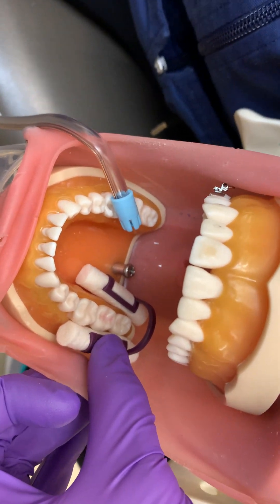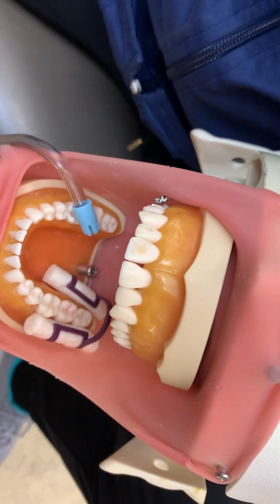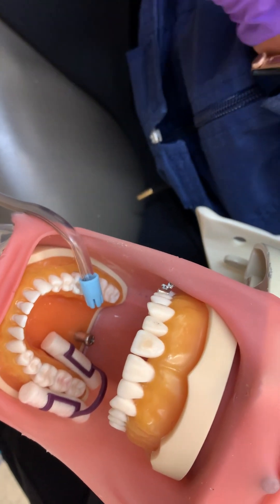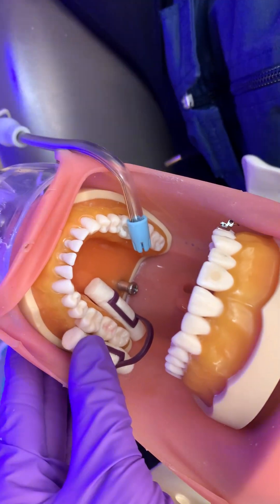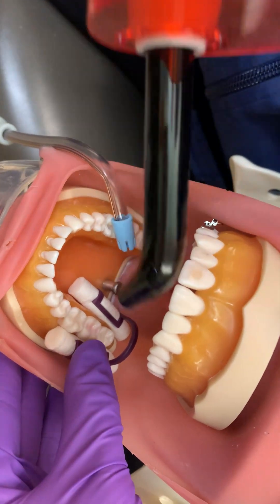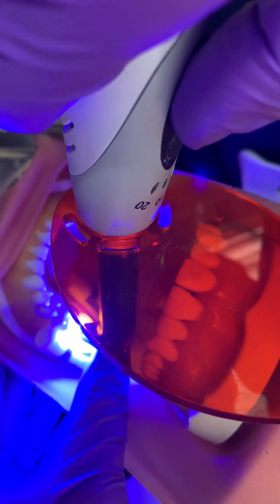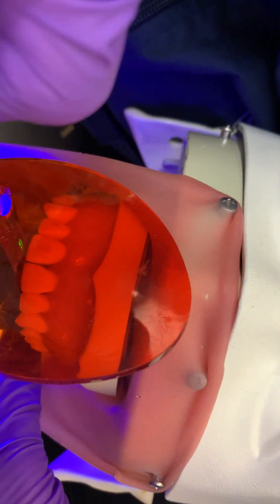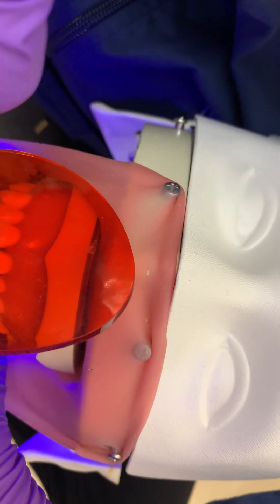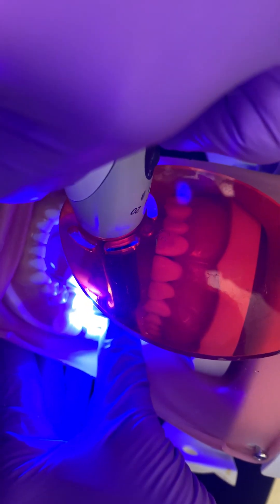Now she is going to light cure the polymerized sealant material according to manufacturer's instructions. ClinSeal requires a 20-second exposure time. You can see we have the orange shield on to protect our eyes from the blue light, and the client's as well. This light is set for 5 seconds, so she's doing it 4 times to make the 20 seconds to polymerize it.